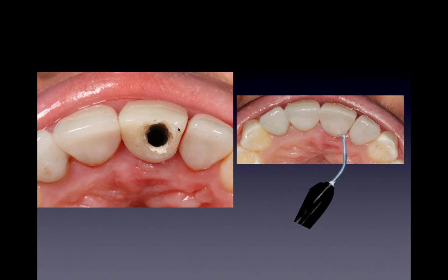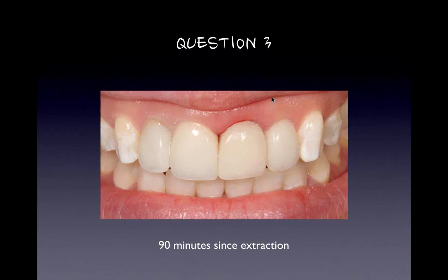That's the way it's done from the laboratory perspective. They get a CT scan of the surgical area, of the surgical guide, and then they get the scan that we've done intraorally. So they're basically mimicking exactly the tooth that she had, and we're just changing the shape of it at the cervical level by using our flowable composite. Close up the access hole.